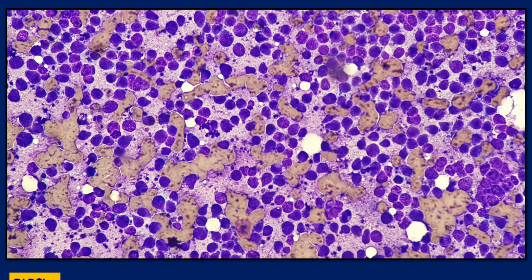Now the next lesion which I'm going to show you is a diffuse large B-cell lymphoma. This is almost a monotonous population of large lymphoid cells. When you see something like this, the moment you have identified the cells as lymphoid, based on the appearance or on the lymphoglandular bodies in the background, I think you are pretty much done, that we are dealing with a non-Hodgkin's lymphoma. And if you run the immune markers and you find it's a B cell and these large cells, then it is a diffuse large B-cell lymphoma involving the salivary gland. Not really a big diagnostic challenge.